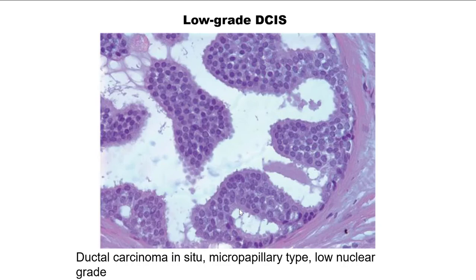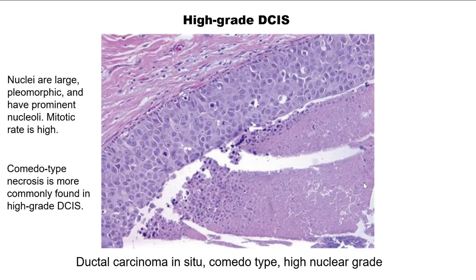Here is another example of DCIS of the micropapillary type, low nuclear grade. Here is an example of high-grade DCIS of the comedotype, with central necrosis that has an expansile appearance, markedly atypical nuclei, prominent nucleoli, and mitotic activity. This is high-grade DCIS.